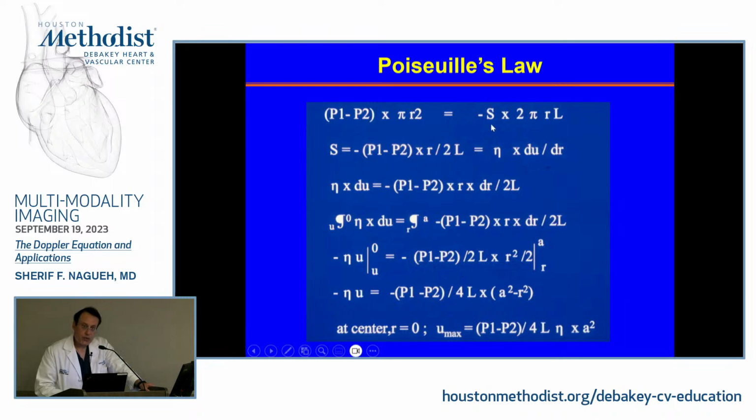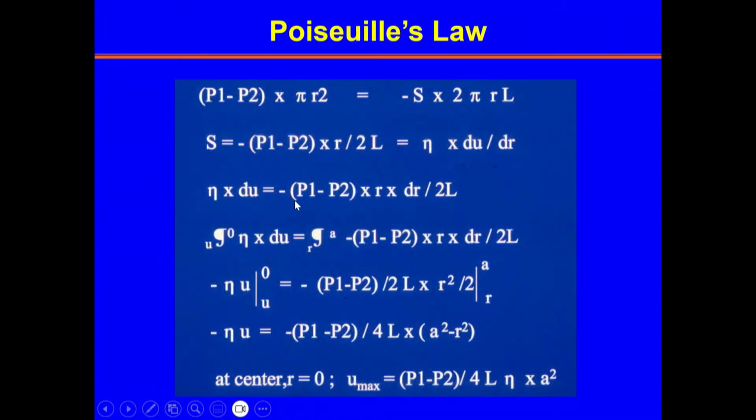But also you know that we just said that blood is a Newtonian fluid, and so that shear tension can also be expressed as the product of viscosity and the spatial gradient of the velocity. Let us again do some rearrangement. It's simply multiplying that dr by the expression on the left-hand side, and that's the first equation we have.